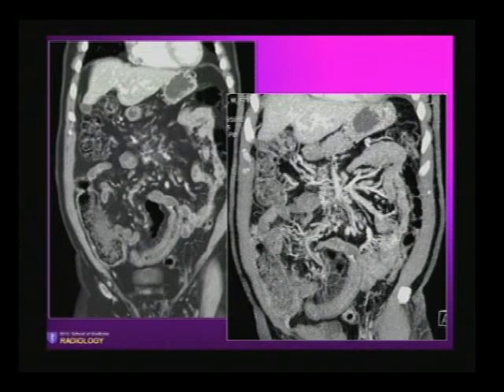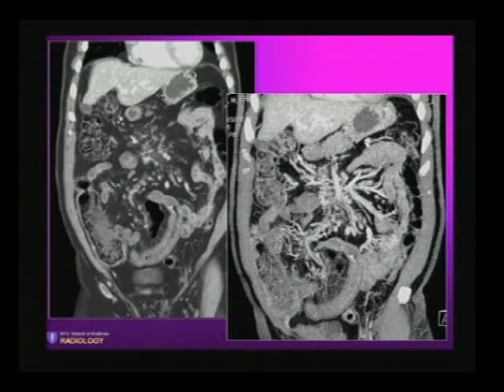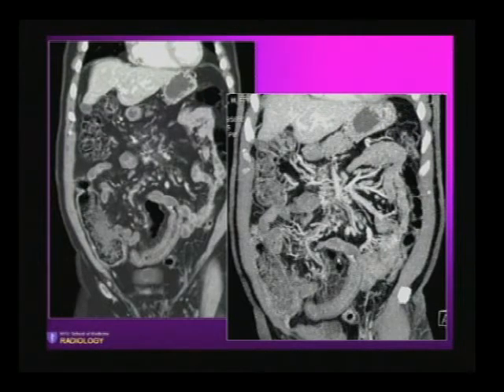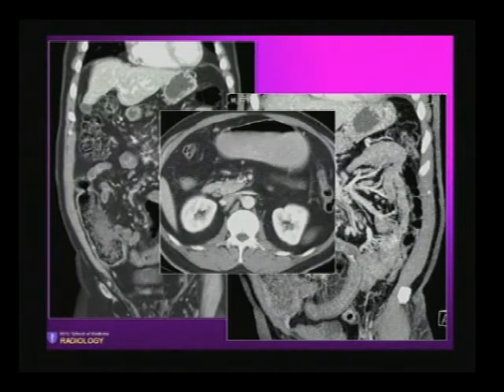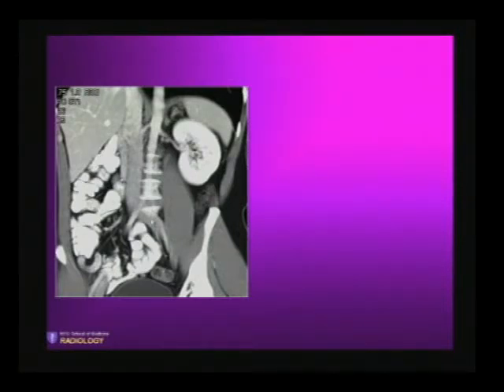Here's a patient with chronic SMV thrombosis utilizing neutral contrast material. You can see the target appearance of the wall of the small bowel. By turning a MIP rendering on, you see that the large branch of the superior mesenteric vein draining the right lower quadrant mesentery is absent. There's almost a cavernous transformation of that superior mesenteric vein — chronic tiny collaterals draining the bowel and extending up along the portal vein. And here's an older scan on this patient showing the SMV thrombosis.